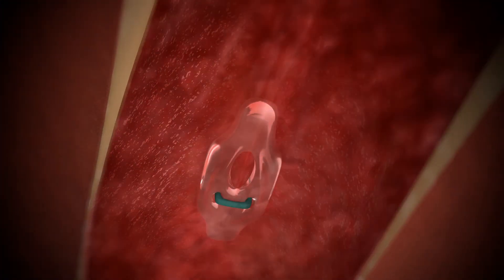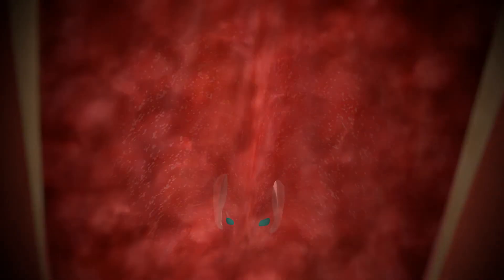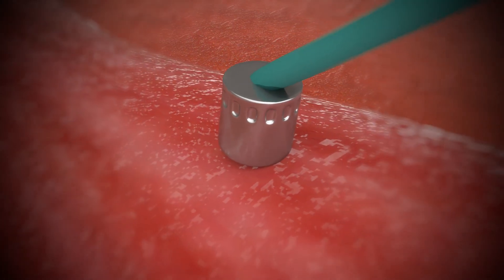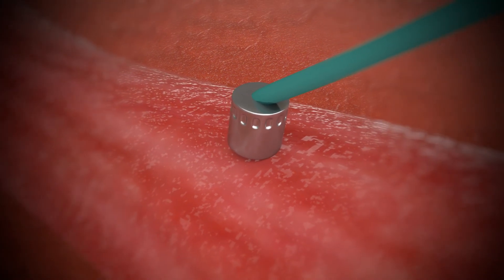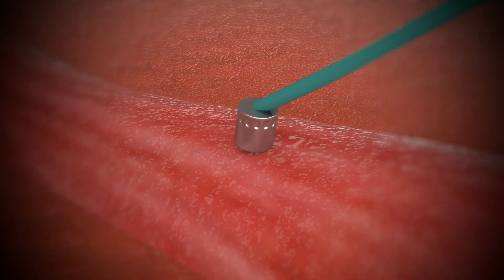The Manta anchor is low profile, non-thrombogenic and resorbable. The radio-opaque lock remains and is angiographically visible to guide future access 2.5 centimeters above or below the previous site.